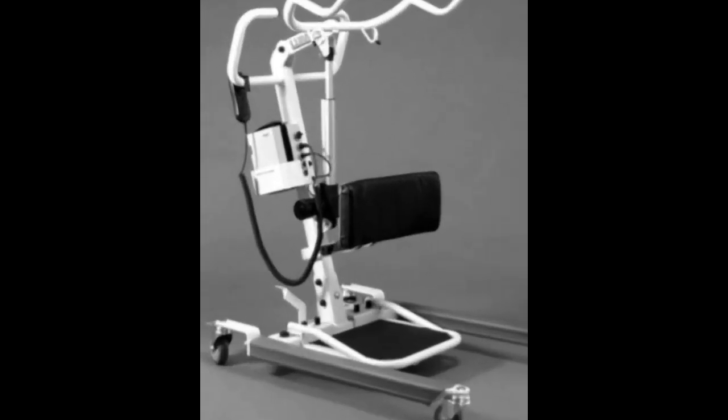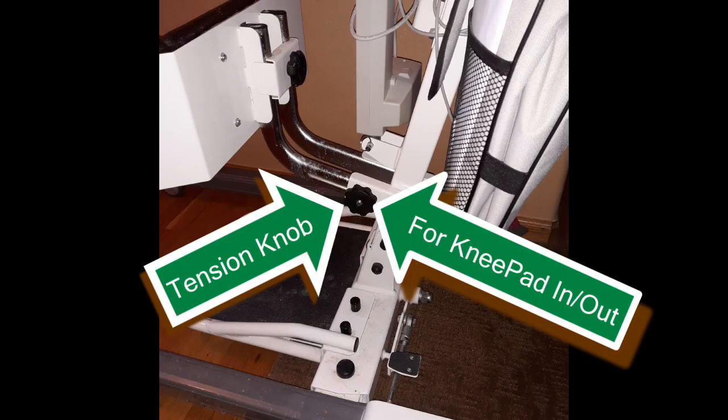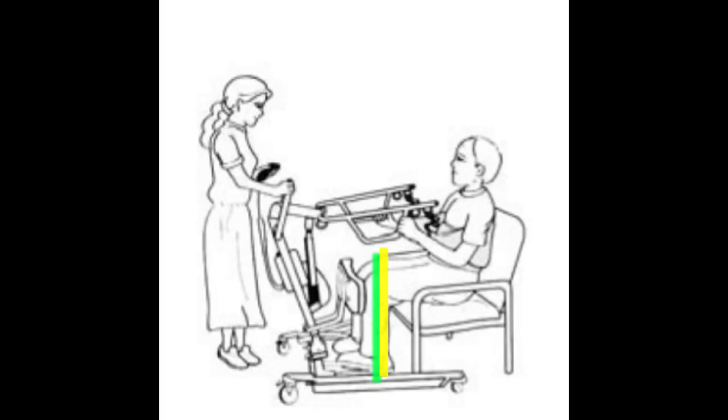There are 2 major adjustments that should be made before the first use and will not require additional adjustments if the same person is being lifted. Loosen the tightening knobs for the knee pad assembly and position the person's feet on the foot plate with their toes slightly to the front of the foot plate. Move the lift forward or backwards until the patient's lower legs are vertical. Now move the knee pad assembly until it rests against the patient's knees. Tighten the 2 knobs to secure the knee pad in place.